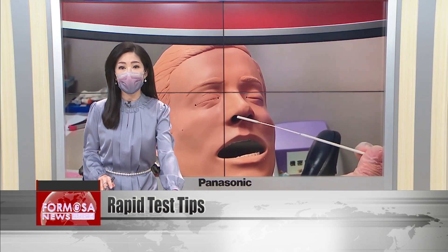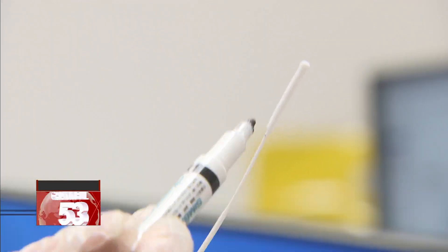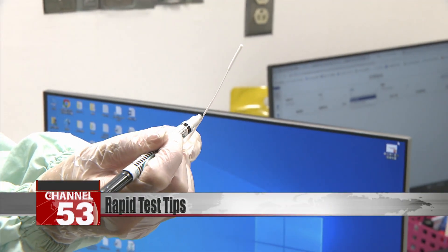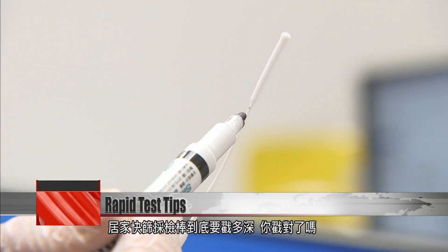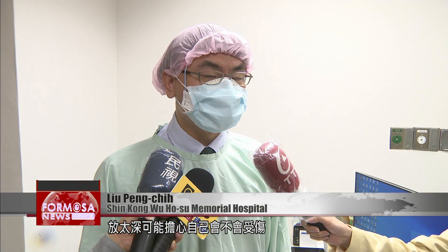He also has tips on how to insert the swab to avoid injury. When using these at-home rapid tests, people might be worried about inserting it too deep and injuring themselves.